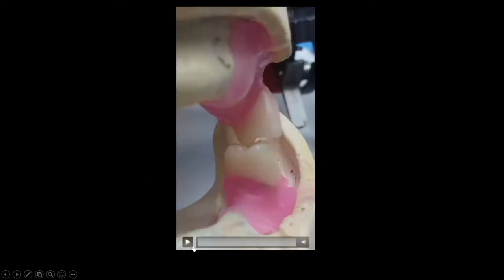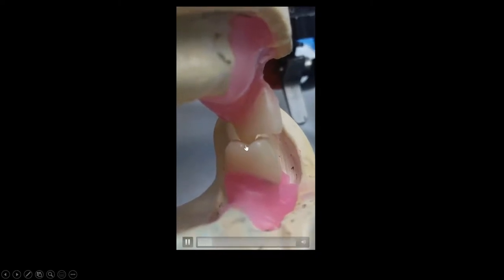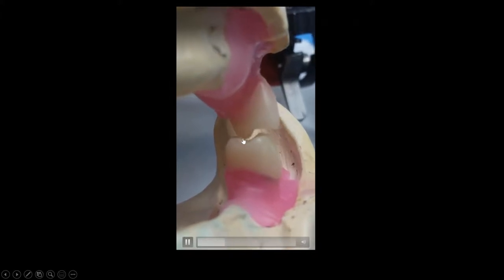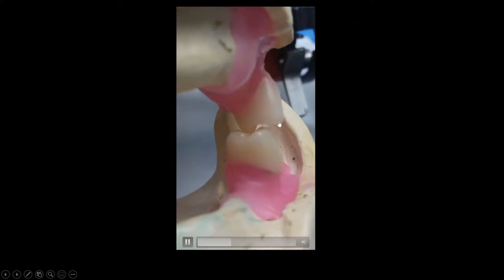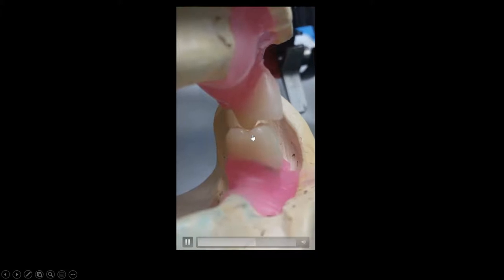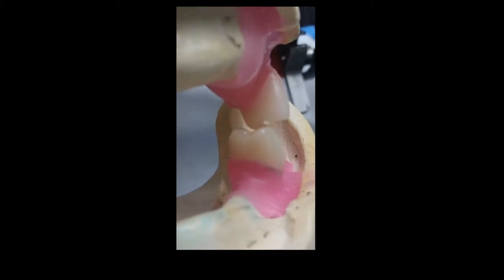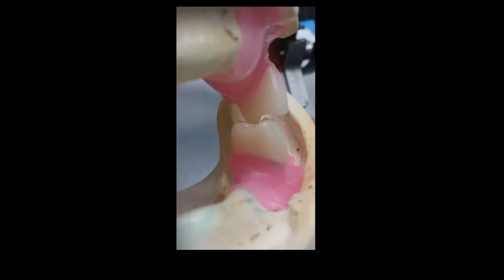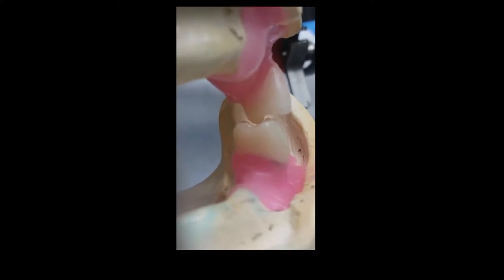This is what it looks like here on an articulator. So now I'm going to wiggle it. You can see it wiggles. There's your freedom in centric in the middle. Now I'm doing working and balancing just like we do, and I tip the buccal cusp out of the way just to show this. That's the freedom in the middle in the centric. My articulator does it. My teeth do it. So that when you land, you're landing on a helicopter pad. It's not a bullseye.